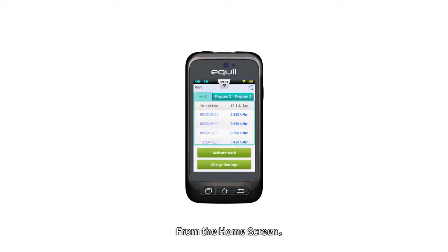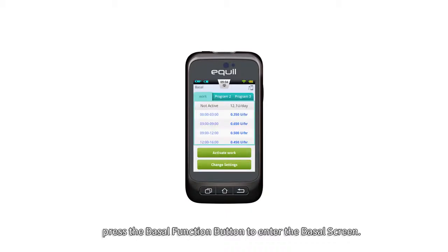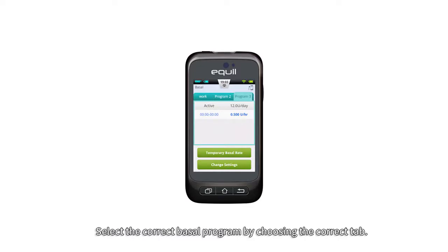From the home screen, press the Basal function button to enter the basal screen. Select the correct basal program by choosing the correct tab.